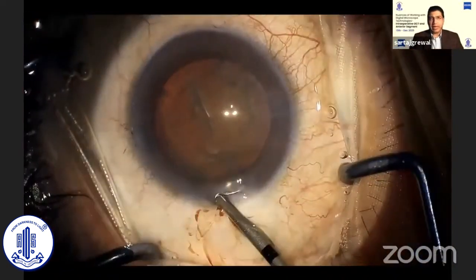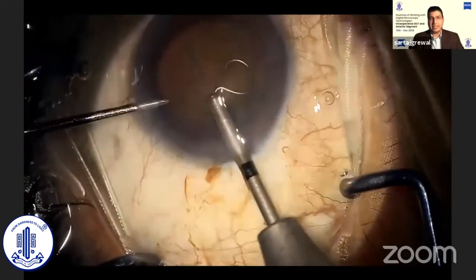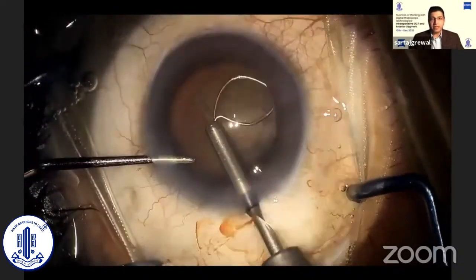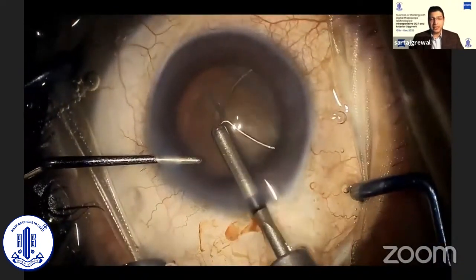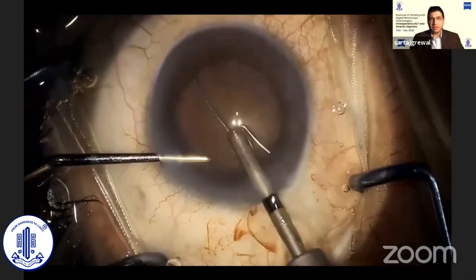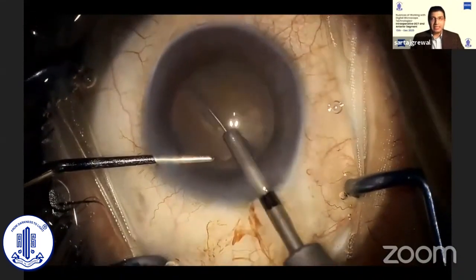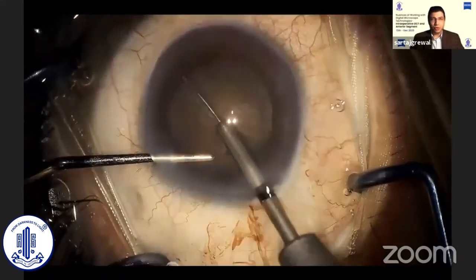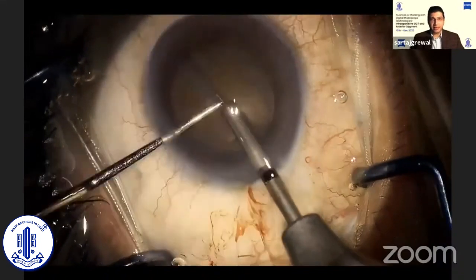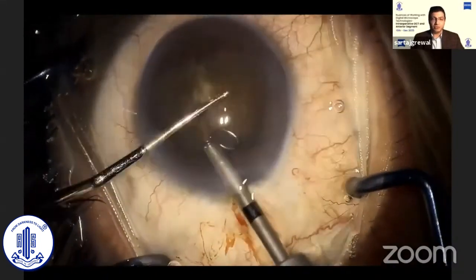This is where the MyLoop comes in. With the MyLoop, we have a device and a technique that makes these hard cataracts no more challenging than any of our other routine cataract surgeries. We can accomplish this without using any ultrasound or laser energy. We can easily divide the nucleus into two or four pieces as we desire. The only prerequisite is that there should be adequate zonular support before the surgery.